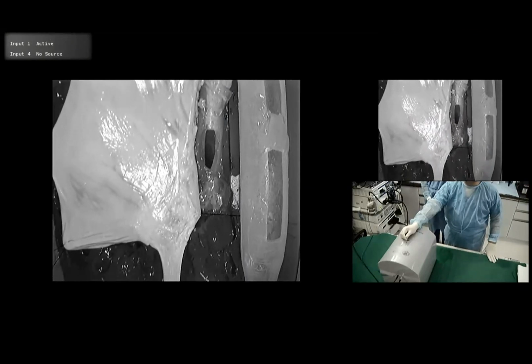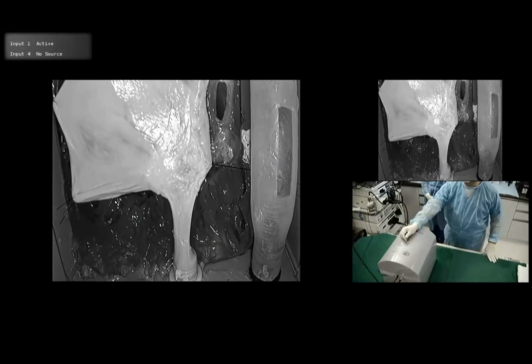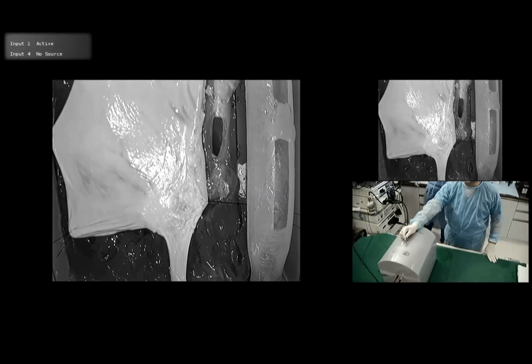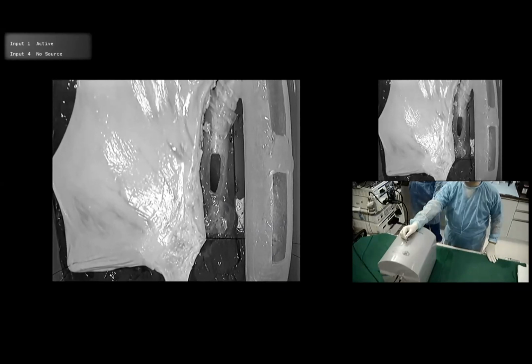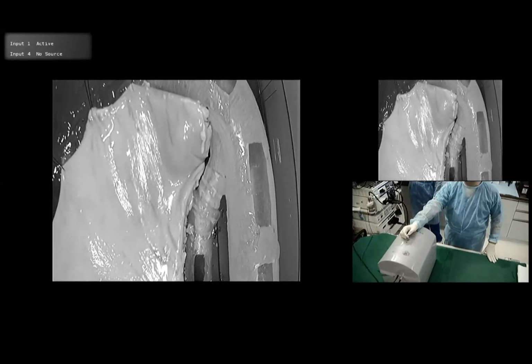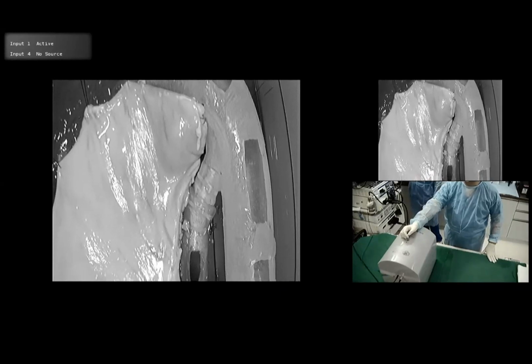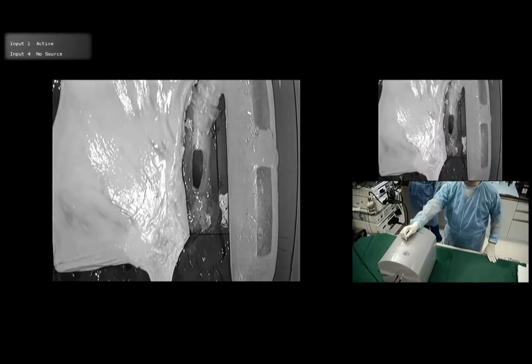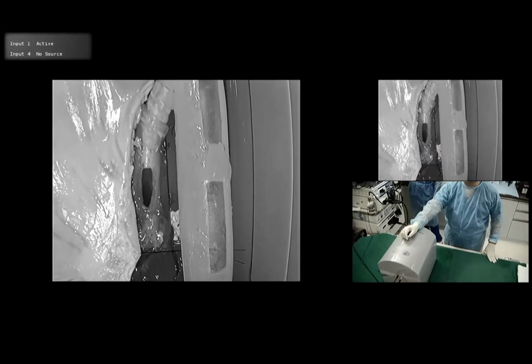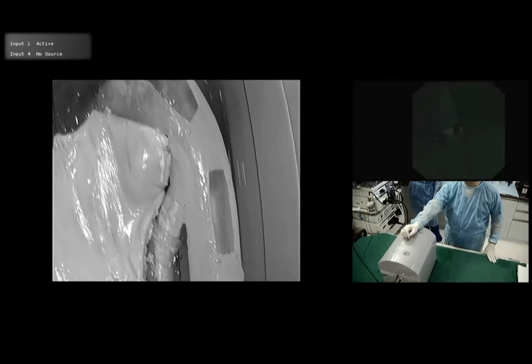You have the esophagus here attached to an inlet, 2-3 centimeters. Then you have a pig stomach, cleaned, sterilized, disinfected. The duodenum is closed. If you see here, the duodenum is sutured. We have removed the natural duodenum. Instead, we have created an artificial duodenum. So if you see this big tube on the right side, this is the duodenum. You see here, it is the C of the duodenum.